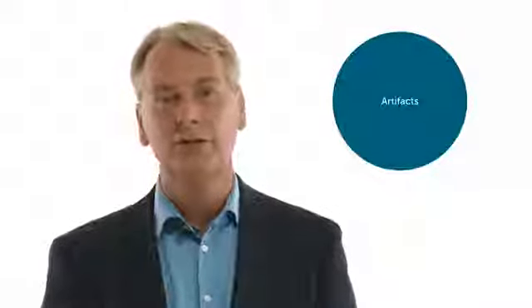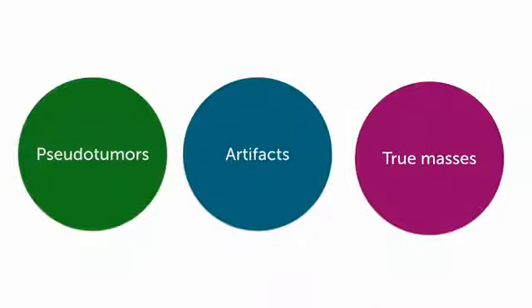It's not uncommon to find some form of a structure in the heart that you think does not belong there. Either it could be a true tumor, a mass, maybe it's an artifact, or maybe it's a structure that should actually belong there and that you just misinterpret as some form of a tumor. These are exactly the topics that we will deal with in this chapter.